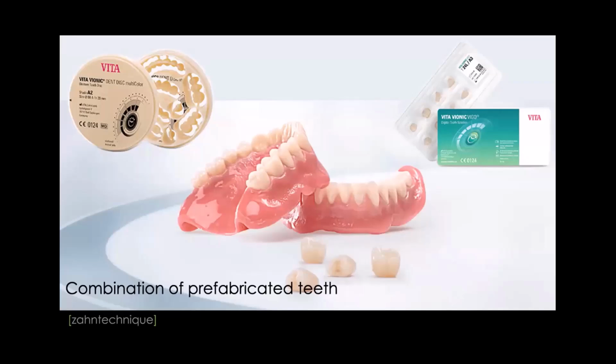Actually, we can design a digital denture, we can print or mill that base, and we can pick and choose the teeth and just bond them in. It's really, really interesting, right? Is it economic? No, it's definitely a higher price solution, but also more aesthetic.